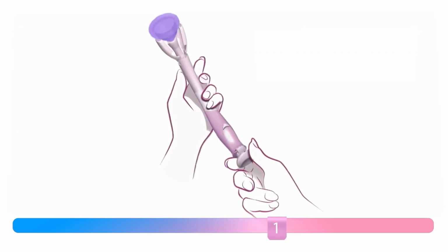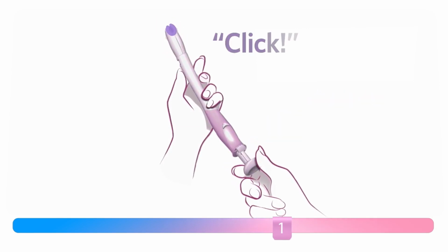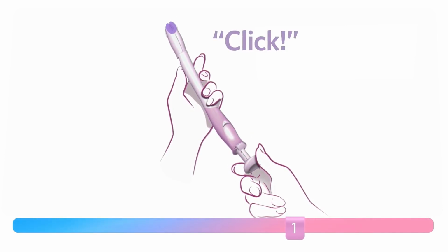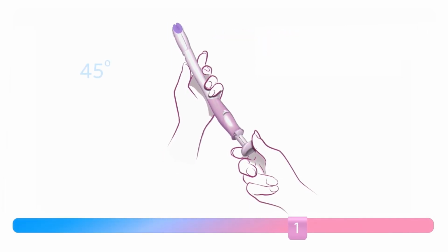Keeping the applicator upright, pull back on the applicator's plunger tab with the raised single dot until the plunger stays back on its own. You will feel a slight resistance. Hold the stem firmly while pulling back on the rear plunger tab until you hear a click. Keep the device upright. Do not tilt the device more than 45 degrees.